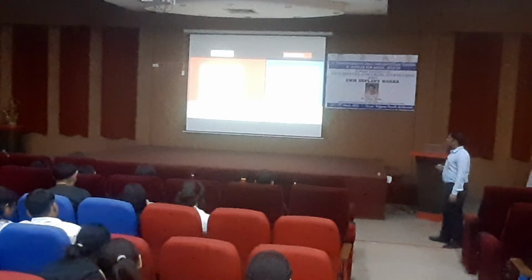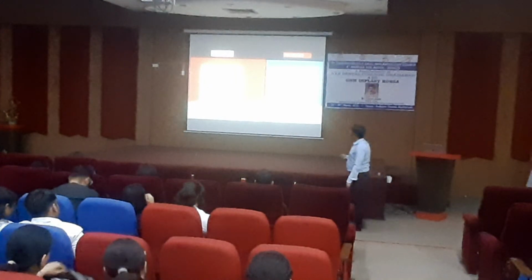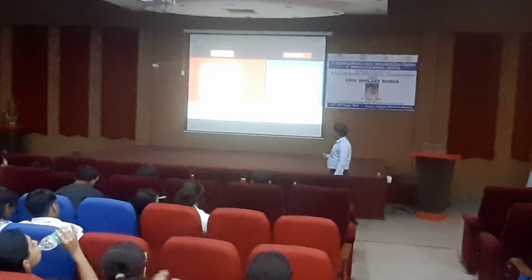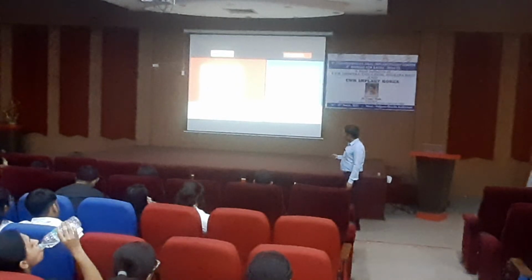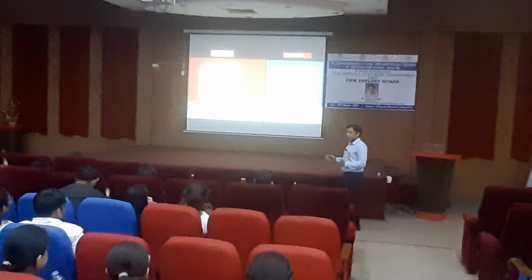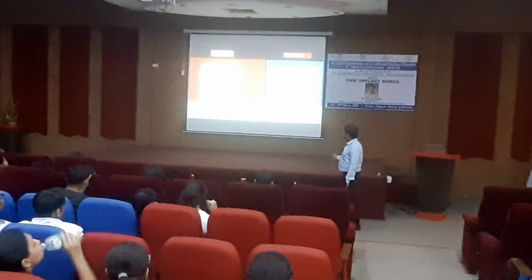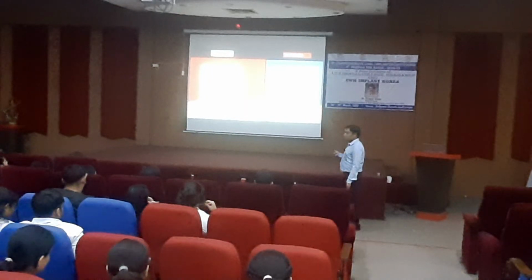One mode is, the first mode is, what is the first mode? What is it doing? Densification of the bone, right? In reverse direction, counterclockwise direction, so if you see here these yellow arrows depict there is a densification of the bone, expanding the bone and densification. The second one is cutting the bone. If you are going in a clockwise direction, it will cut the bone and the bone is coming out.